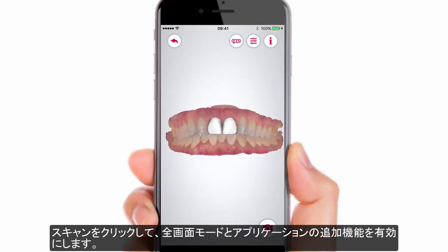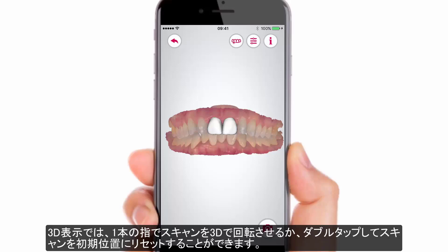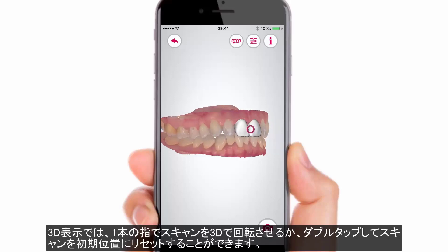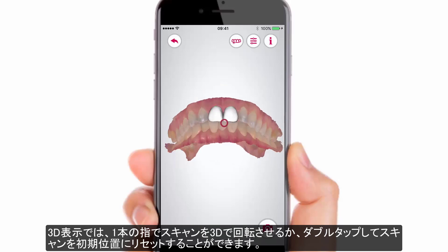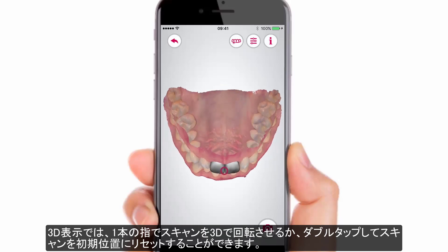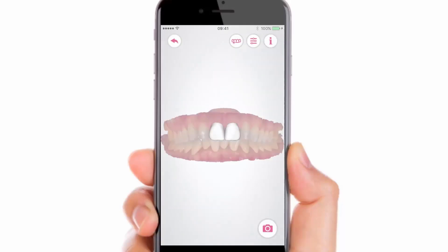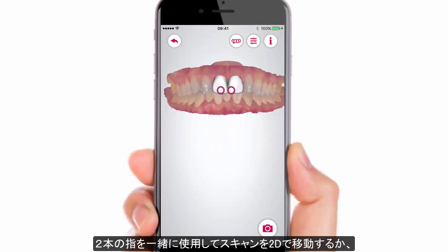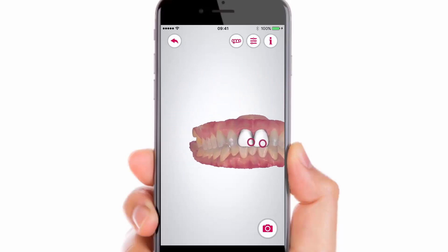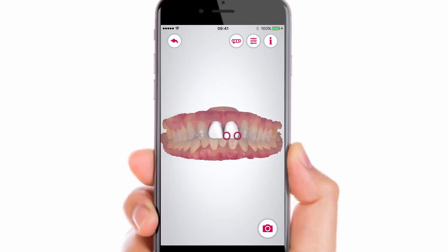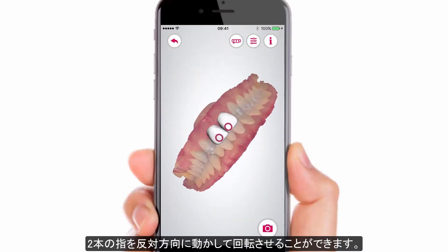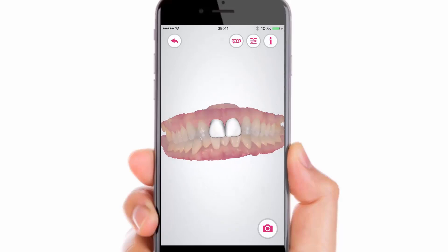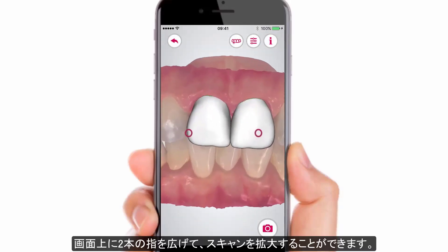Click on a scan to use the full screen mode and extra functions added to the application. While in 3D view, use one finger to rotate a scan in 3D, or double tap it to reset it to the initial position. Use two fingers together to move a scan in 2D, or move two fingers in opposite directions to rotate it. Spread the fingers on the screen to zoom in on the scan.